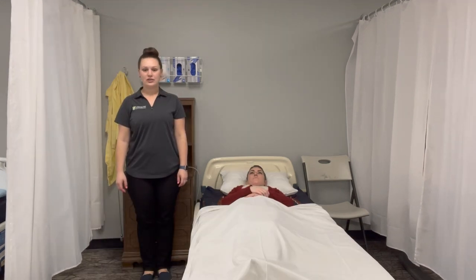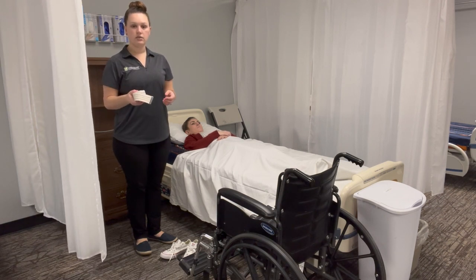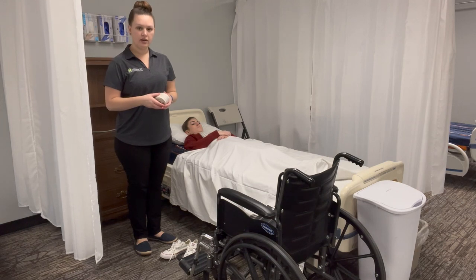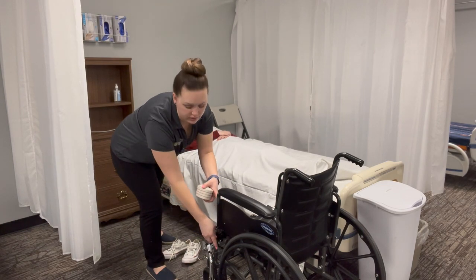Now that we've washed our hands, we're going to gather our supplies. For assisting Allison to the wheelchair, we're going to use a gait belt and our wheelchair. We want to park our wheelchair next to the bed and move the leg rests to the sides and lock the wheels.